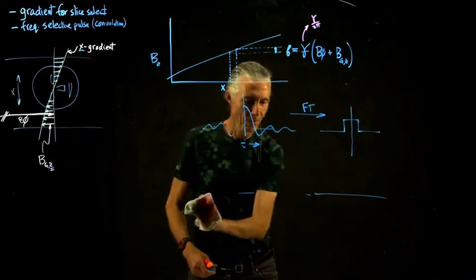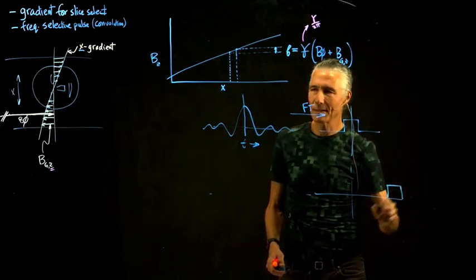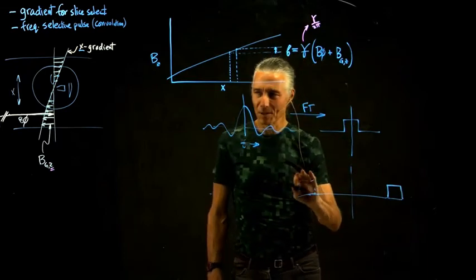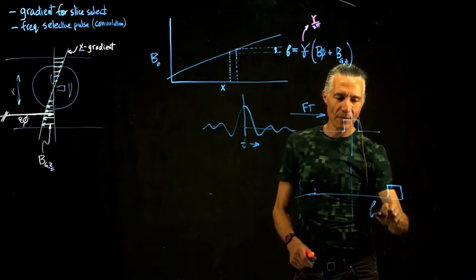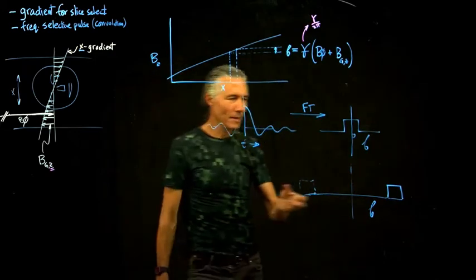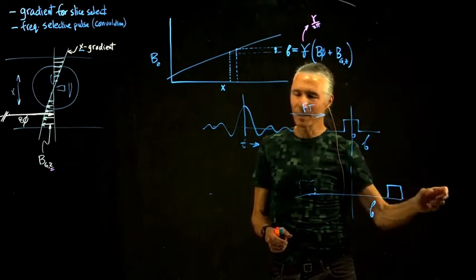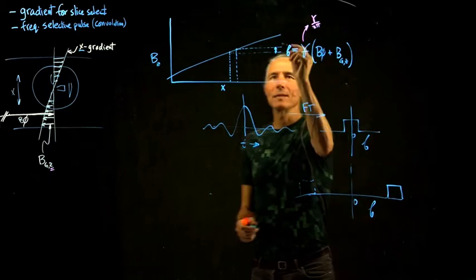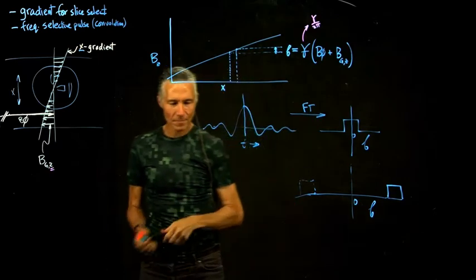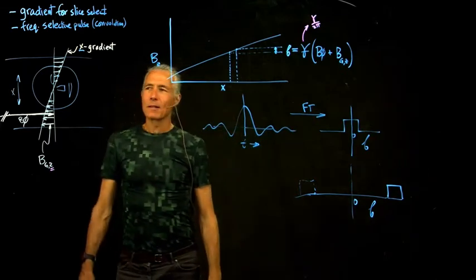Wrong quadrant there. We don't want a band of frequencies around 0. We want a displaced band of frequencies like this. Since we're in the Fourier domain, there are going to be some negative frequencies, but we'll ignore those for now. So that's our goal. What do we need to do to get a narrow band of frequencies that's displaced away from 0? We need from this frequency up to that frequency. That's our basic problem.